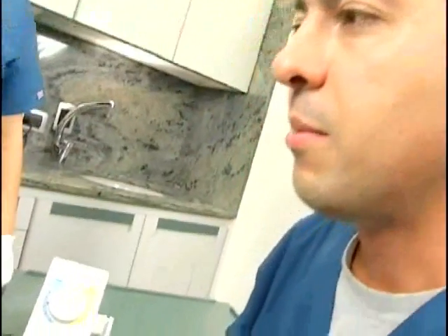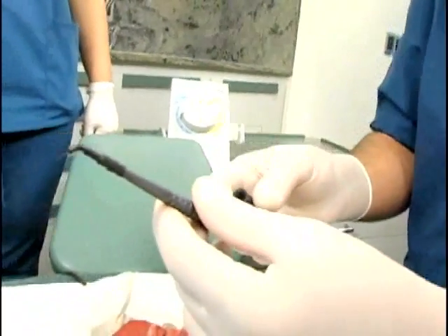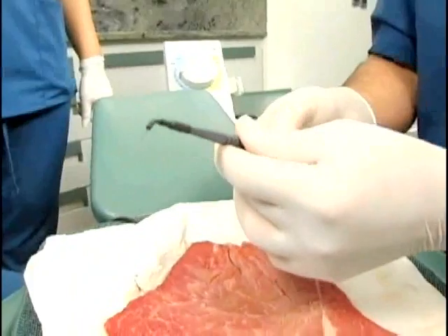To finalize, we are going to practice with the straight knife electrode, which is very useful for hard to reach areas.